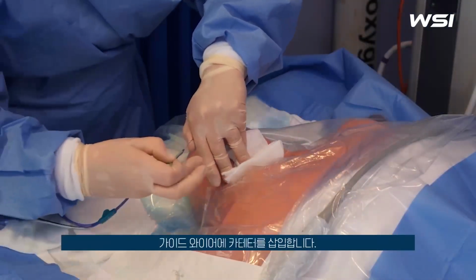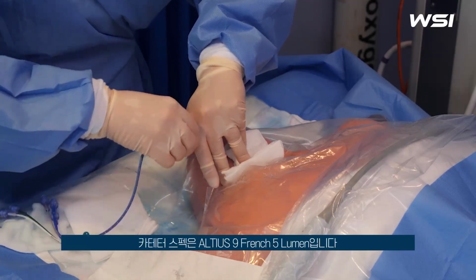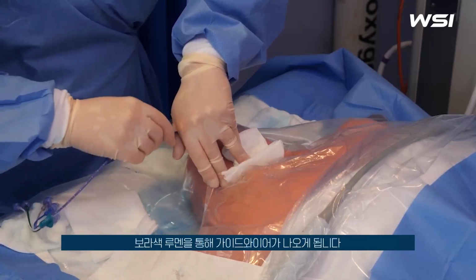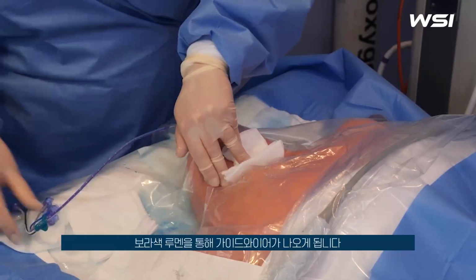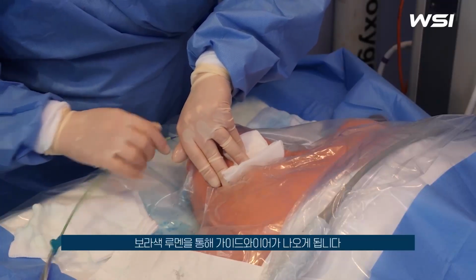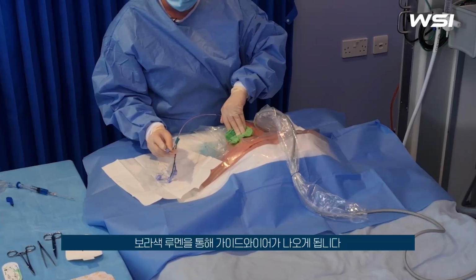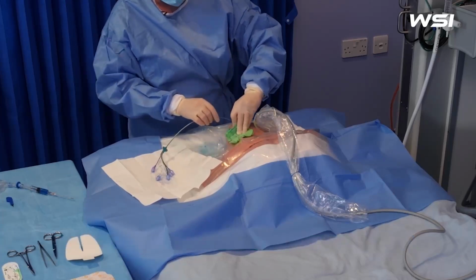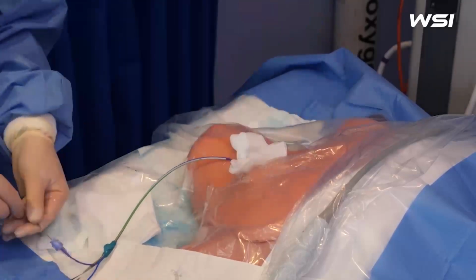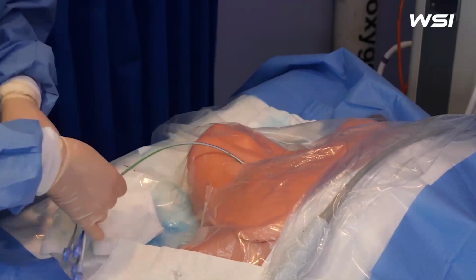Now, this is just to remind us all, this is the 9 French Altius 5 lumen. The guide wire will come out through the purple lumen and will be gripped by the Luer valve. So that's come out there. Technically, we don't need to hold that now, but I would always advocate that you actually make sure you've got a real hand on a guide wire. And swap hands.